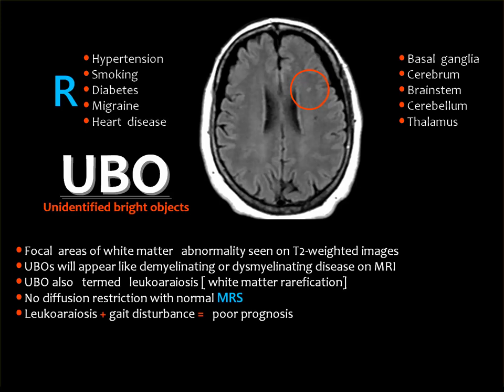Let us say he or she has some headache or other minor symptoms. Then the report will say that there is a bright focus in the white matter and no edema, no mass effect. Then in the conclusion, they say that this may be ischemic or maybe a demyelinating focus, for neurophysiologic studies.